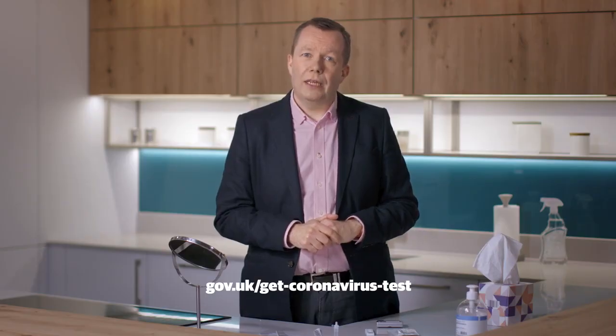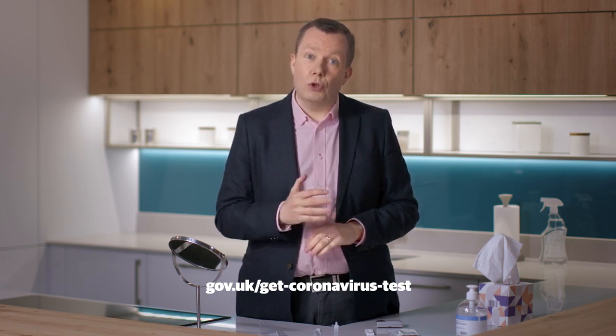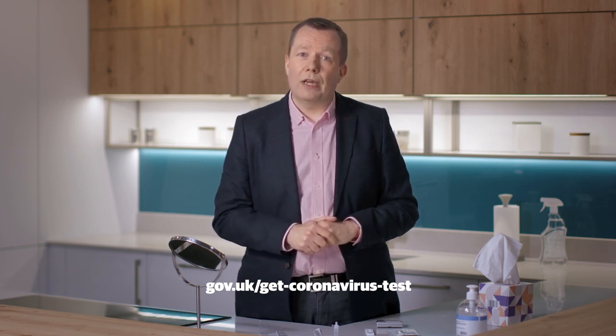You and your household must self-isolate immediately. Once you have registered your result online, you must book a confirmatory PCR test as soon as possible via gov.uk/get-coronavirus-test. A contact tracer from Test and Protect will call you after registering your positive result and they will give you advice about what you need to do, including around self-isolation. They will also contact your close contacts and provide further information, including requesting them to self-isolate.